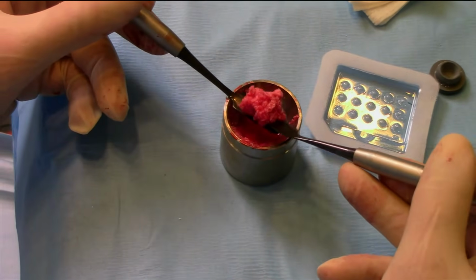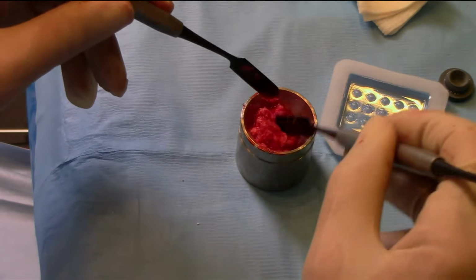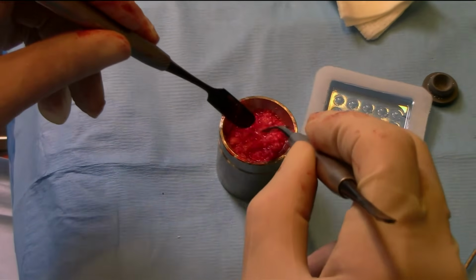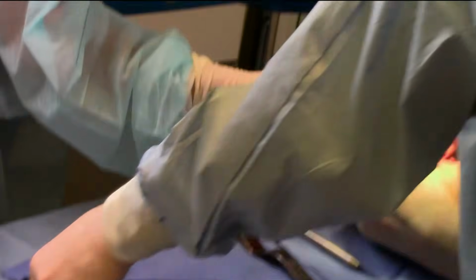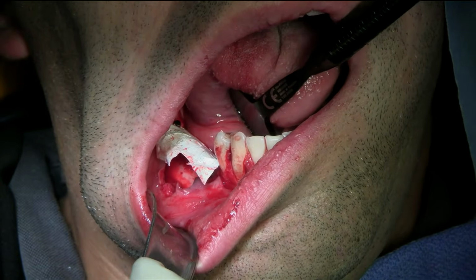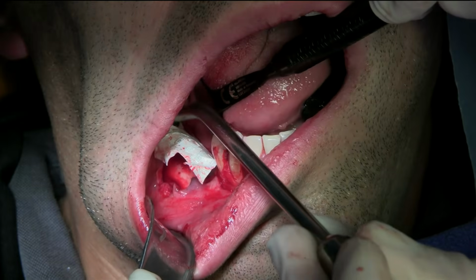So that's quite a bit. And just so you know, we're going to have to switch to the other. Okay, so, you can do it now. So let's go to the retractor. We're going back to the oral cavity, and now we have to really retract well. I have to open the membrane, and we have to start condensing the bone.